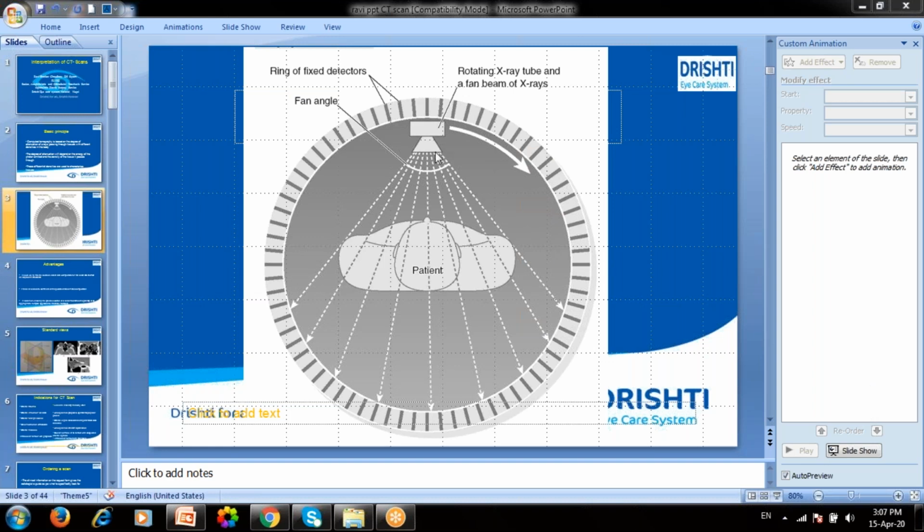So what is different in dynamic? They increase the rate of the scan, like if it is 1500 scans per minute, then they increase it a little bit more. If you want finer detail, then MRI has to be done. Generally in fracture cases, and if you think there is any injury in the brain, in those cases the dynamic scan has to be done.